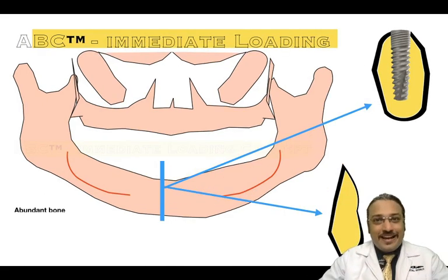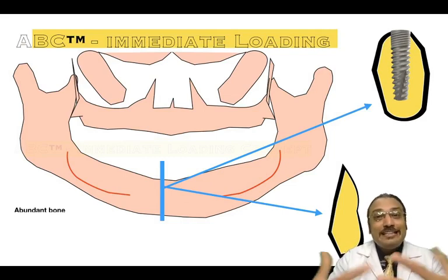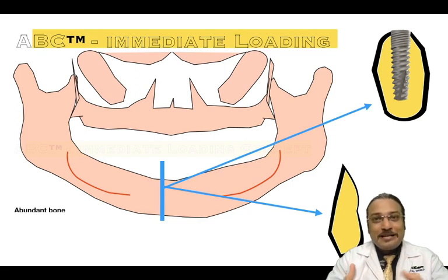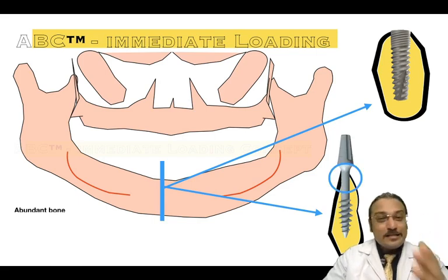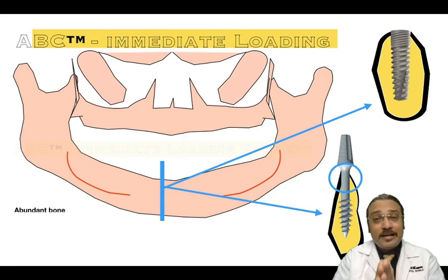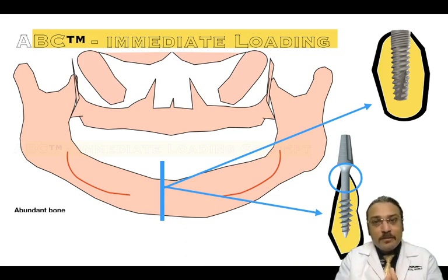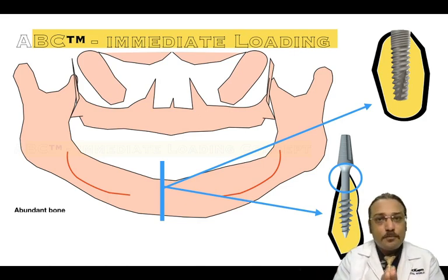Whereas instead of modifying the bone, why not modify the design of an implant so that it can be conducive even in such a resorbed jawbone. Now if in this situation the implant is modified, the width of the implant in the crest region, that is in the region of the neck of the area of the bone, is reduced, and the implant, as you see, goes down, becoming more and more wider. So that is ideally matching the morphology of the resorbed bone.